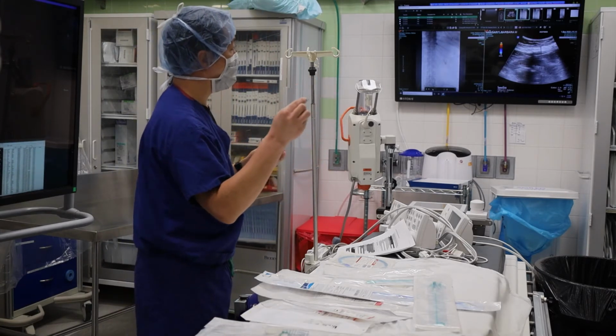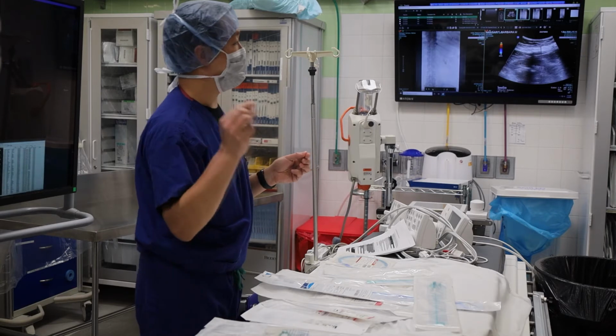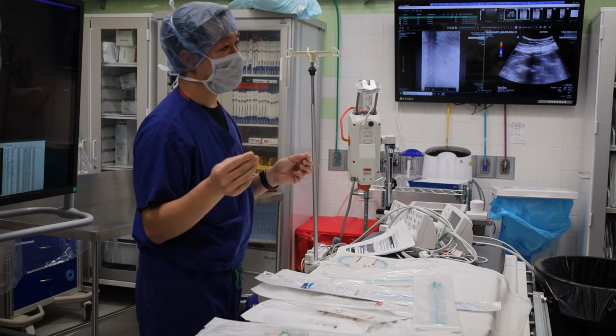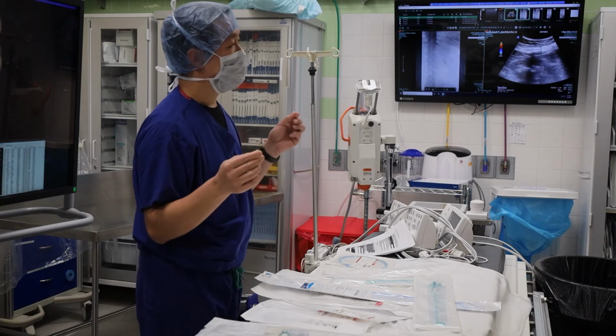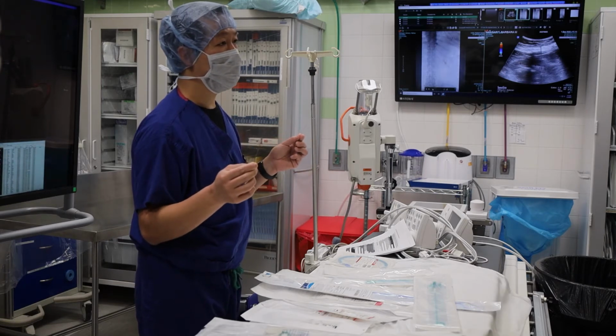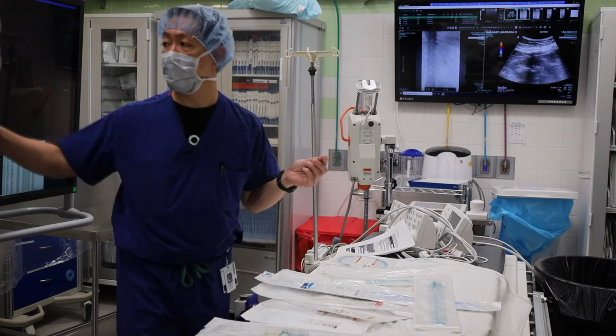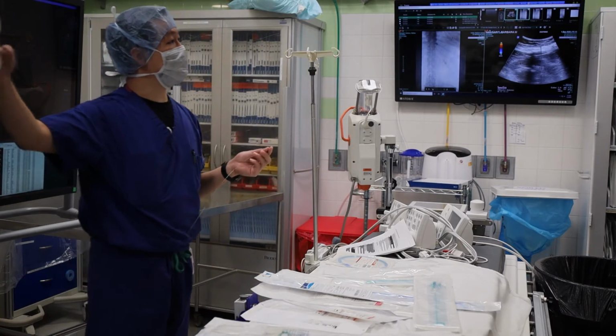0.018 or smaller wires we might ask for are Nitrex, Glide, rarely V18. Do you know why we don't want to use a V18? It's too stiff, right? And you can actually go through and through the kidney. That's the same reason why.